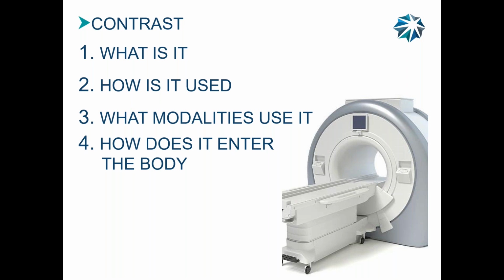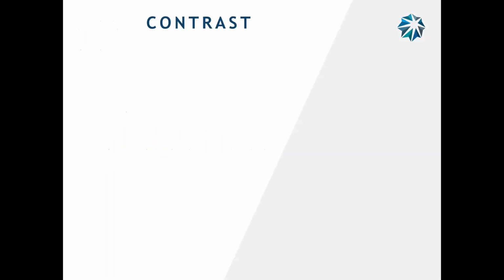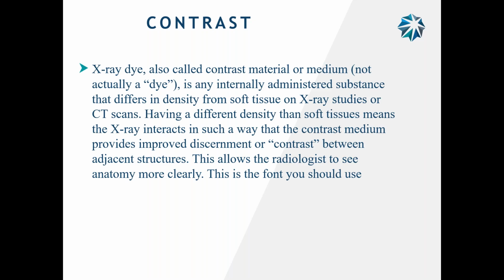How is contrast used? What modalities use it? And how does it enter the body? Again, what is contrast? We've all heard it used in the hospitals, right? So contrast, also called a dye, which is not what it is. Does this look like a dye? It's clear, correct? So it's not a dye, but everyone refers to it as a dye.